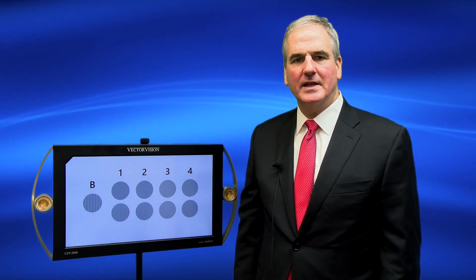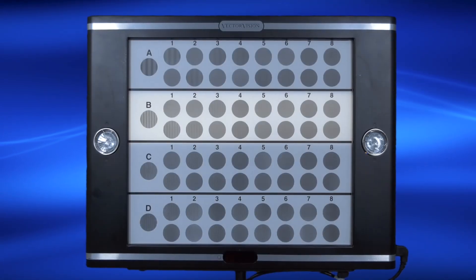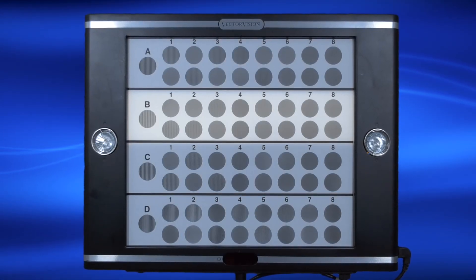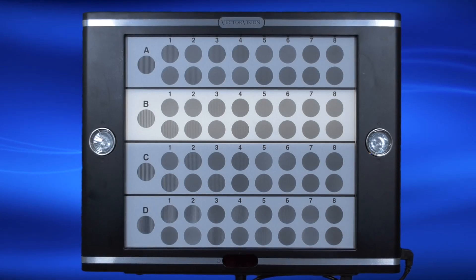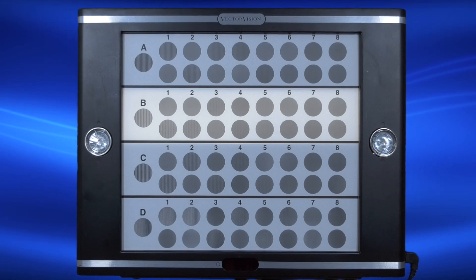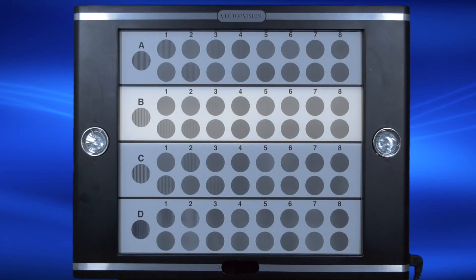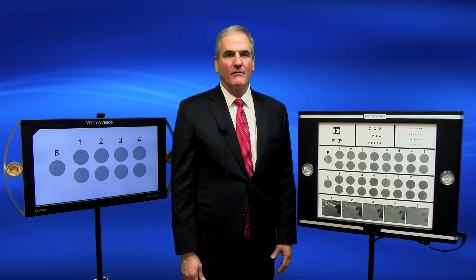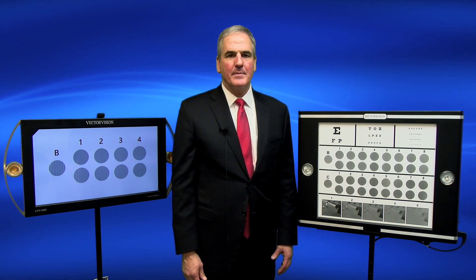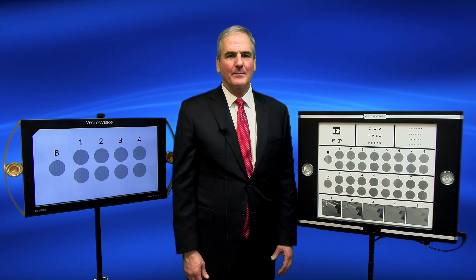We recommend for cataract evaluation the use of Row B, shown here on the CSV 1000. Row B represents six cycles per degree, which has been shown by research to be the most closely tied to real-world vision testing. Row B also provides an accurate measure for a functional acuity score, which can be recorded in your EMR to document the real-world vision loss of your cataract patients.